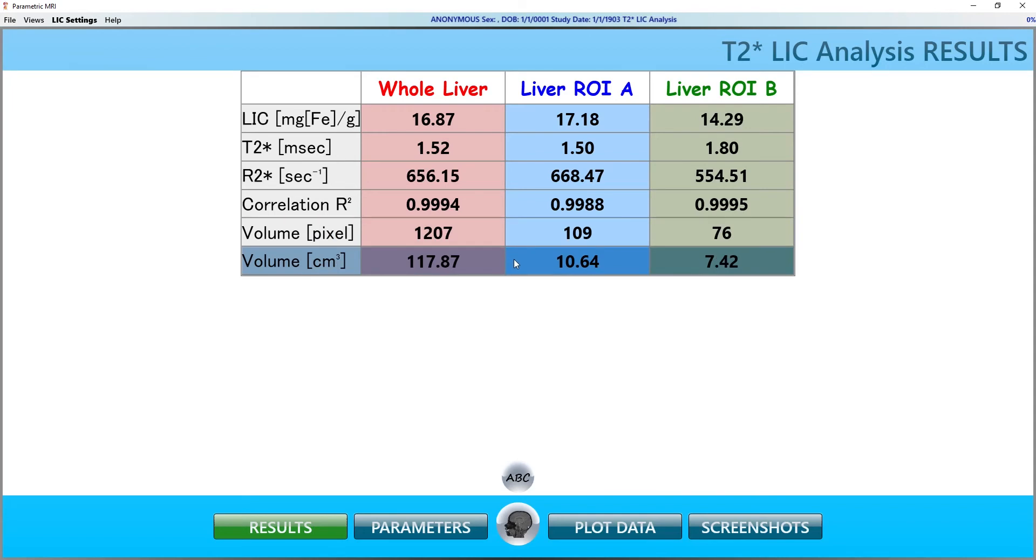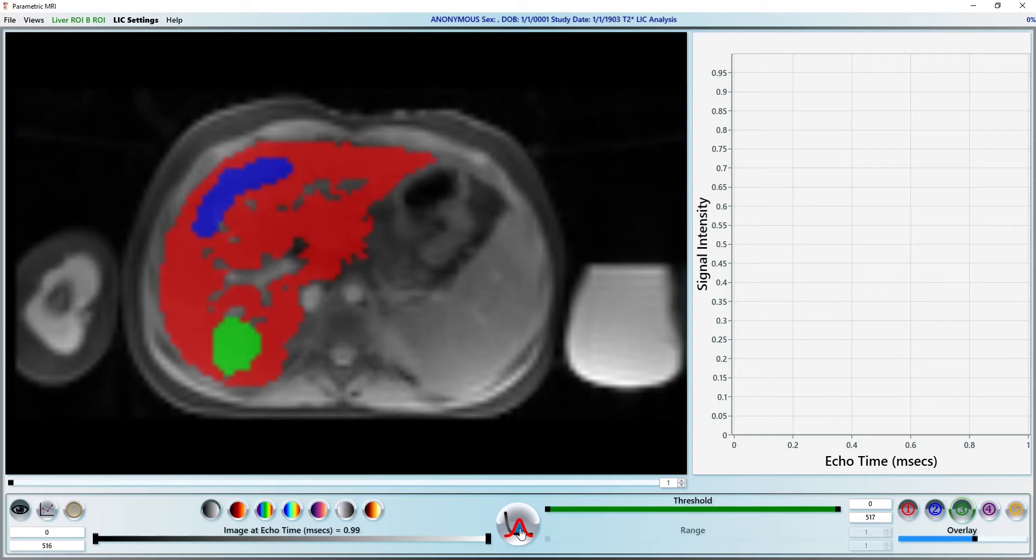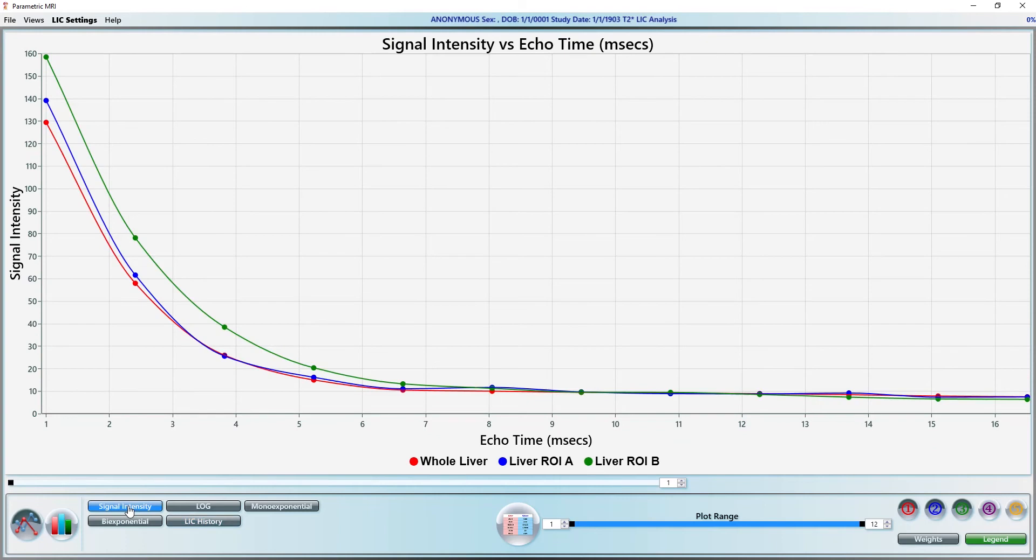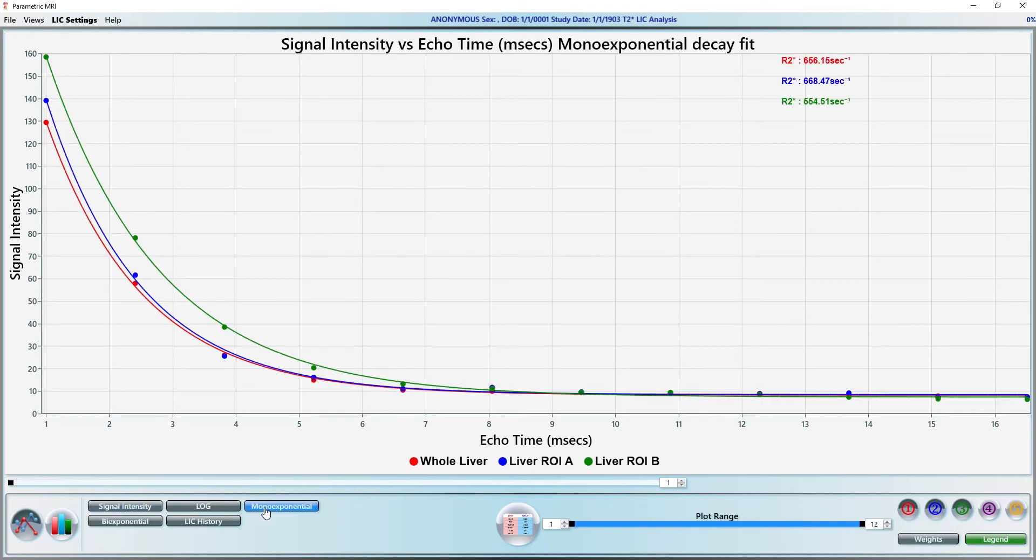Next, let's see how the mean R2 star values were calculated. Go to the Curves page by clicking the Page Navigation button twice or press CTRL-4. Let's switch the plot to signal intensity versus echo time. The average signal intensities from our three ROIs are plotted against the echo times from the scan.